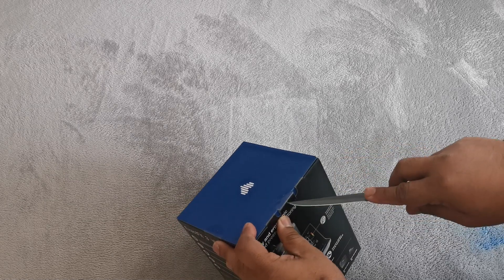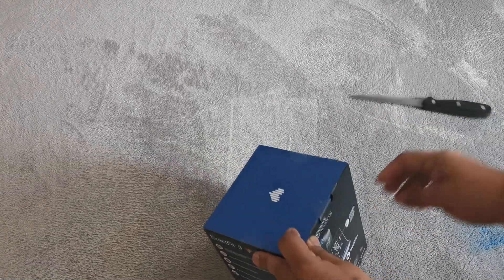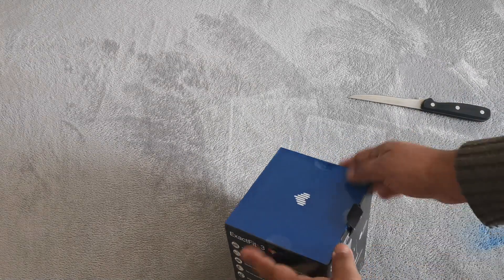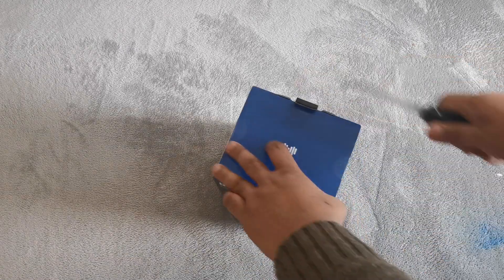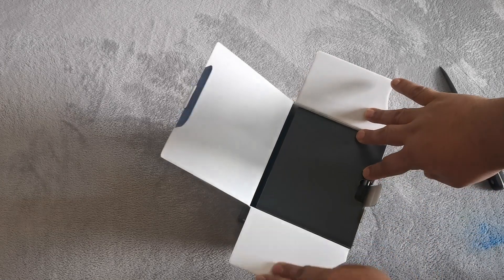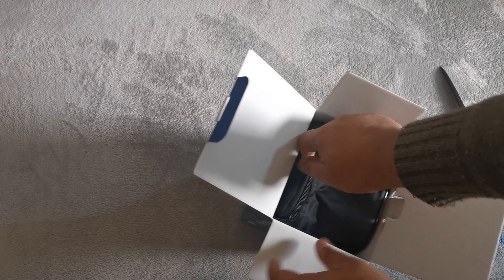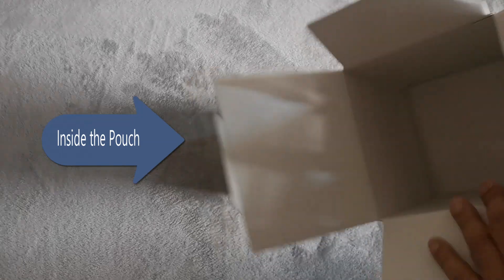So there's a seal — let's break the seal first. There you go. Okay, so it seems like everything is inside the box. I'll just take this one out.